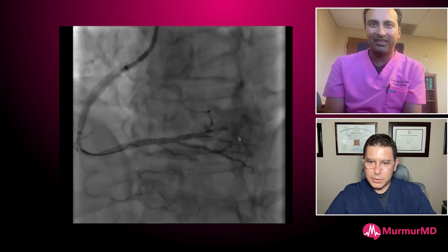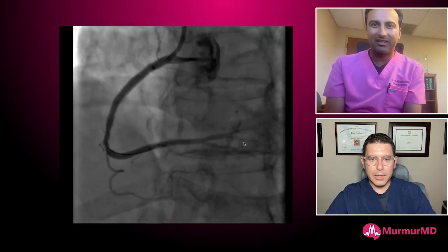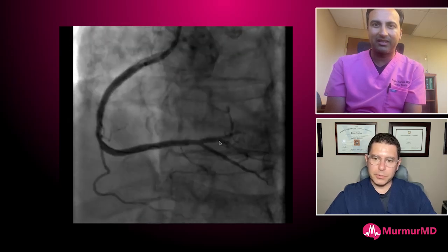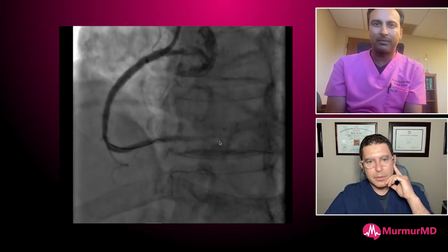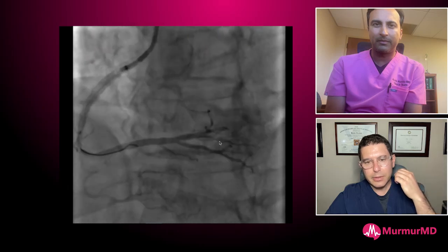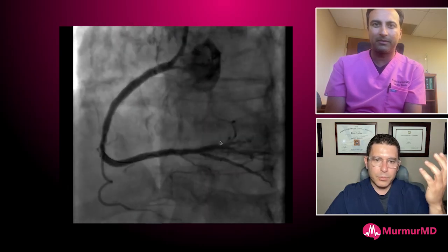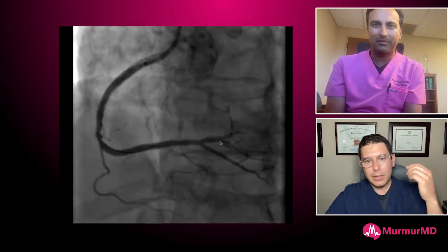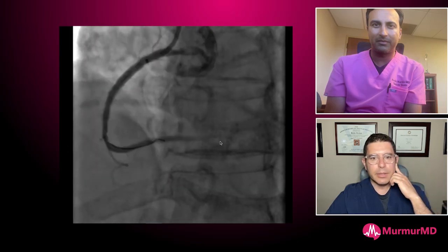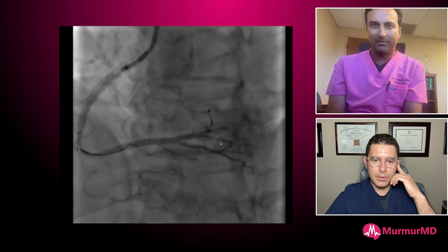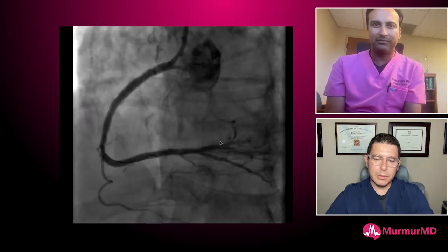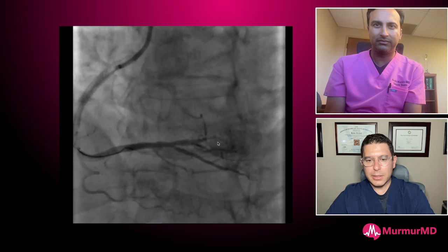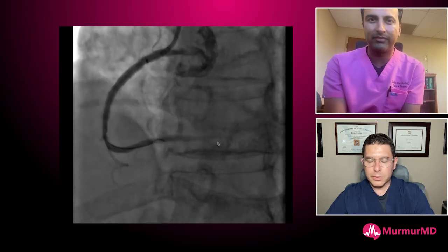There's a little distal embolization in the right posterolateral branch which we chose not to chase. He wasn't on antiplatelet therapy before arriving so we were hopeful it would resolve. The unique aspect of this case is the acuteness — we're seeing more STEMIs with calcified nodules and plaque erosion. Shockwave is very helpful here: it's safe, doesn't cause embolization, and if the patient can tolerate the inflations — which most can in an occluded vessel — it's a great option.